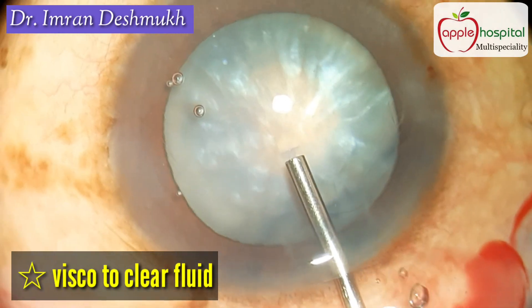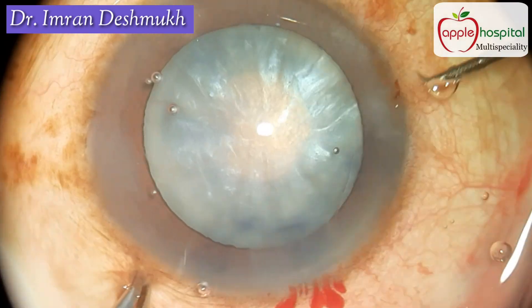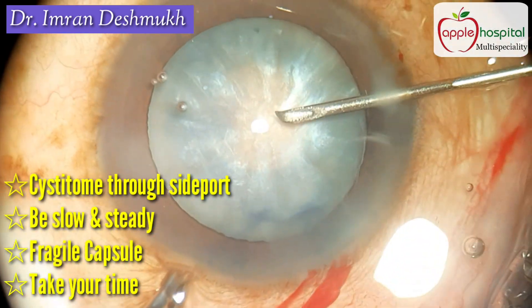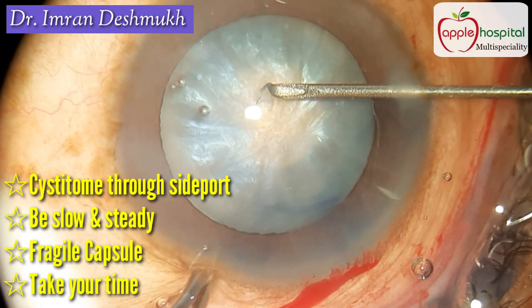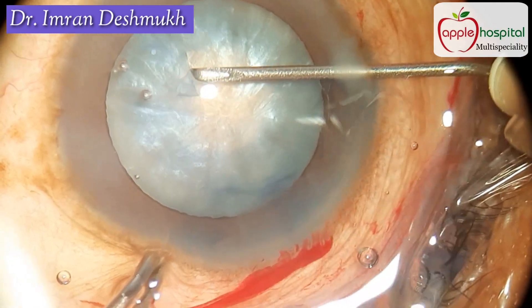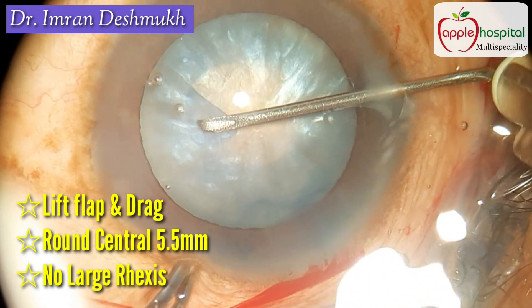Now again use a lot of viscoelastic, as this will maintain anterior chamber stability. Then enter through the sideport using the cystitome. Be slow and steady — the anterior capsule is very fragile and very lax, and it can easily extend to the periphery. Take your time, be slow and steady, lift up the flap and drag it in a round circular direction.